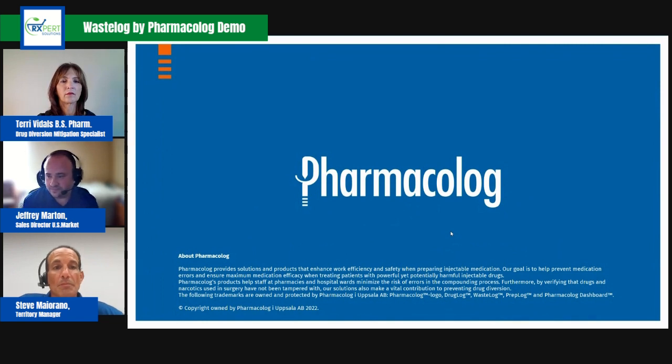And that's it. So back to the question earlier, Terry, on the different workflows. The workflow that we just went through is the workflow that would be utilized by pharmacy. So a pharmacy at the end, when they're actually able to see the result right then and there immediately. If it was where the end user or the provider was actually performing the test, once the test was performed, it would just say, thank you very much, test complete. And then the pharmacy staff would go to the dashboard to see what the actual results are.